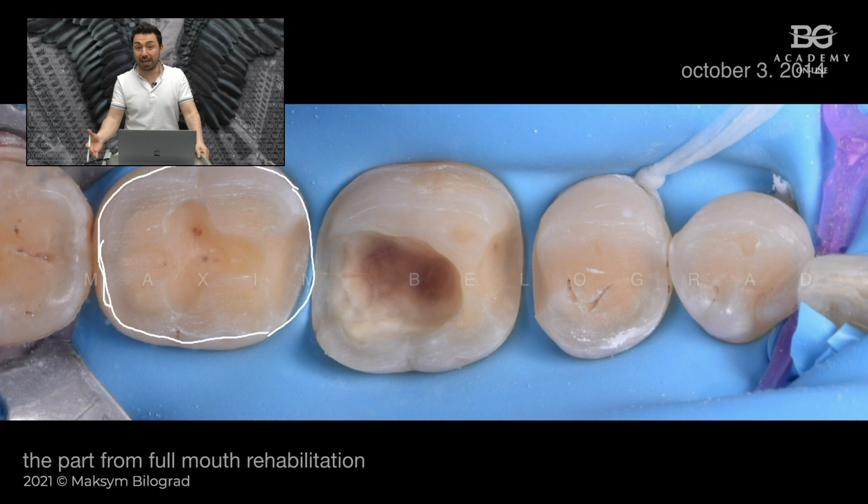And it is not retentive. It is a completely adhesive restoration that has to be bonded. So that is tabletop. Why tabletop in this case? Because the second molar is not visible in the smile line. When the patient is smiling, laughing, or screaming, you cannot see the vestibular and lingual sides, so we can be really conservative with our restorative components.